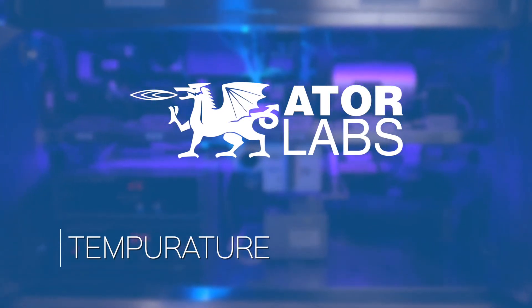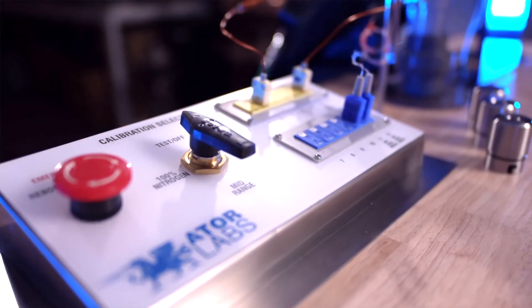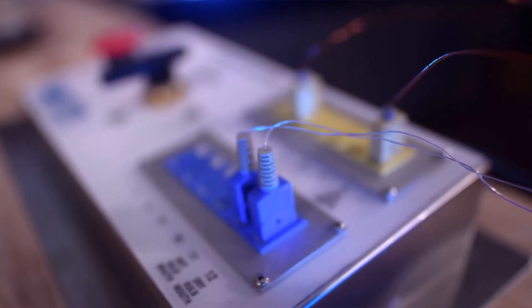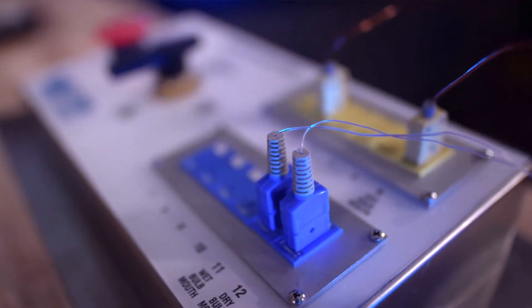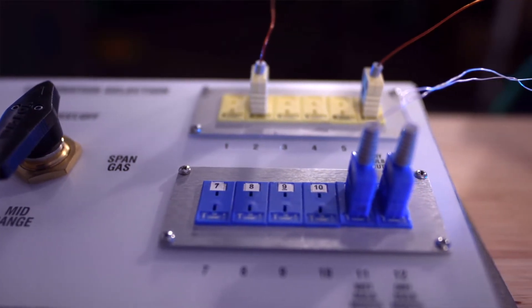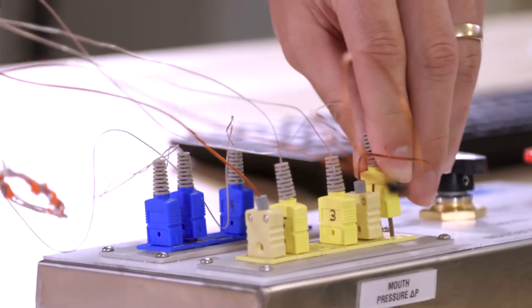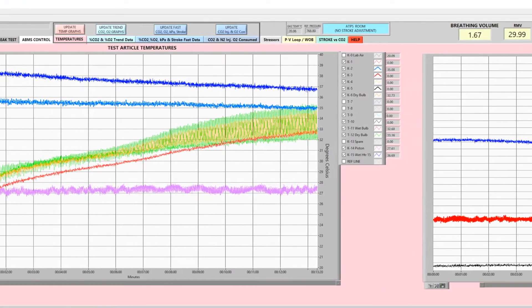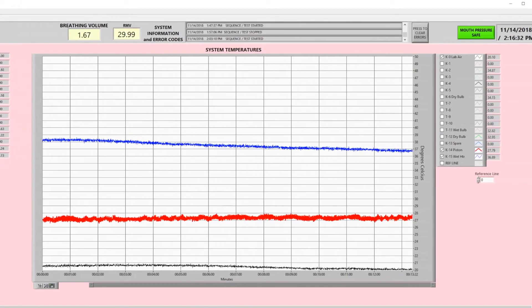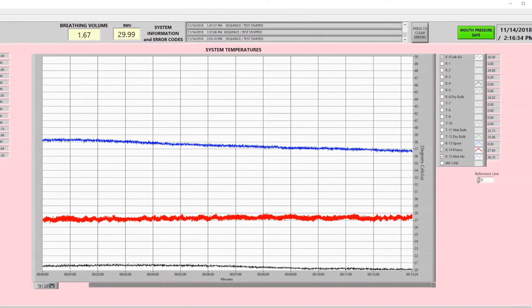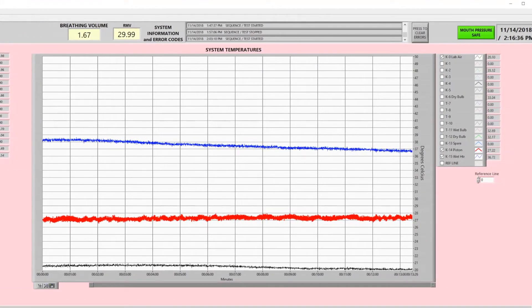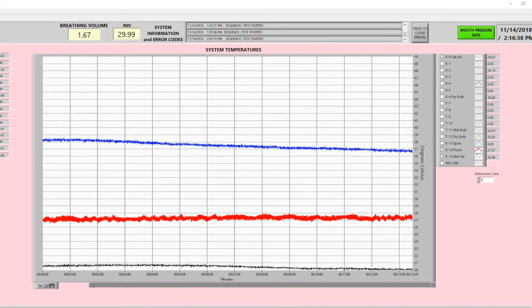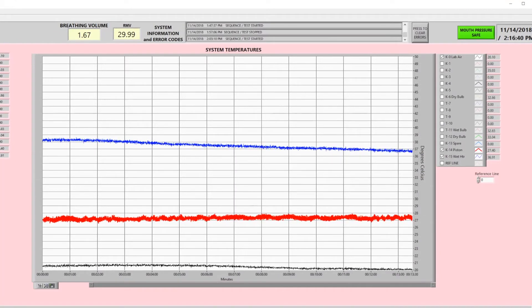In this video segment, we're going to review some of the temperature evaluating capabilities of our system. Here on the panel, we have an additional set of temperature probes that the user might wish to plug in to investigate some temperature changes within the apparatus under test. The system has several of its own monitoring temp probes. Here on the right screen, we track the system temperatures, the wet heater, the mouth temperature, and the room in which we are testing.